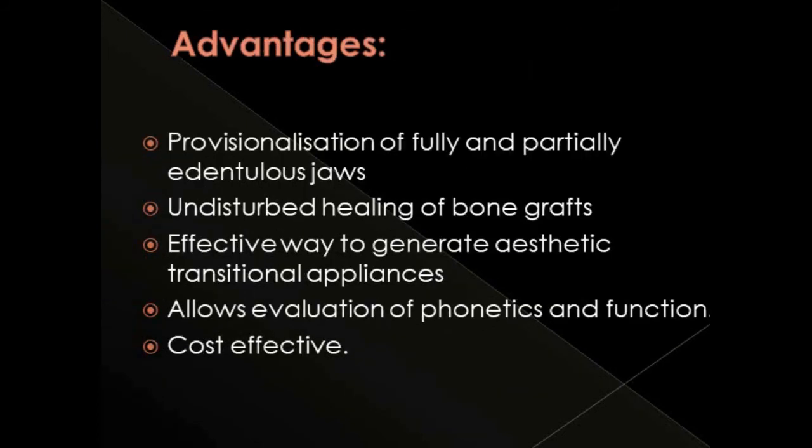Coming to advantages of transitional implant. So the main advantage is provisionalization, and then it causes an undisturbed healing of the bone graft, and it's an effective way to generate aesthetic transitional appliances, and also it helps us to evaluate phonetics and function during the healing phase only, and it is cost effective.